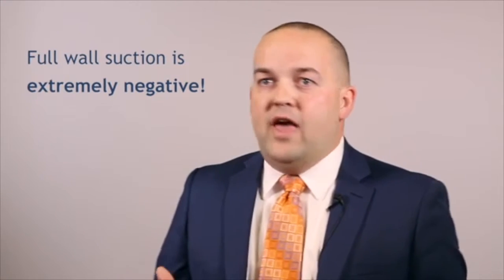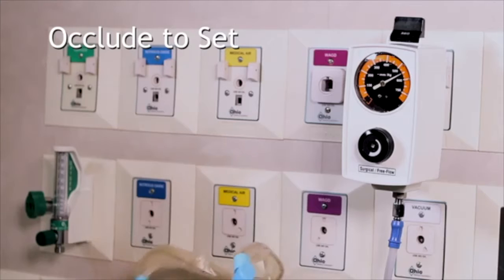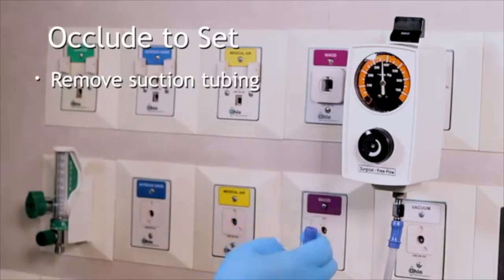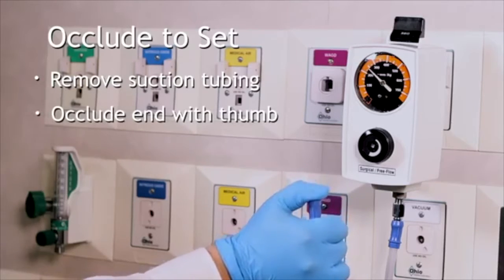Full wall suction pressure is extremely negative, so we need to be careful and make sure we set it appropriately. The first method is what we call 'occlude to set,' which means we should always remove the suction tubing from the actual suction catheter we're using and occlude the end of it with our thumb.